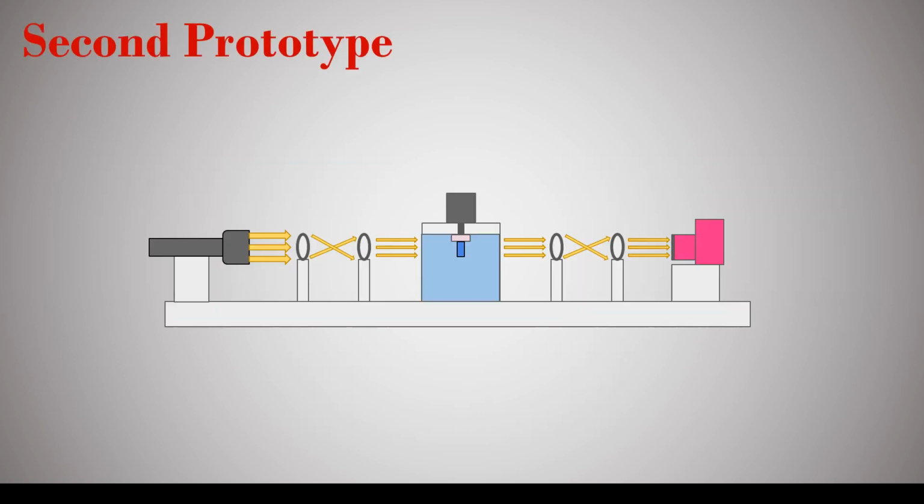We moved on to a more complex setup utilizing lenses to create a parallel beam from the light source to the sensor array. We also used a container that was acrylic filled with water to limit diffraction. We then designed and 3D printed a track and sliding pieces for each component to align everything and create a straight line from the source to the array.